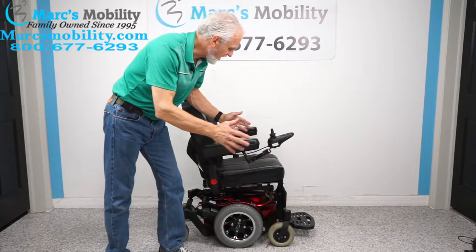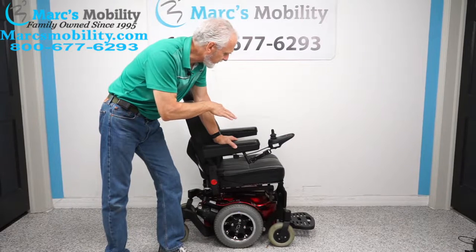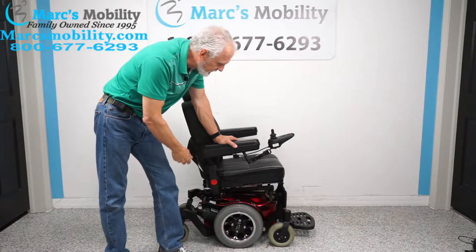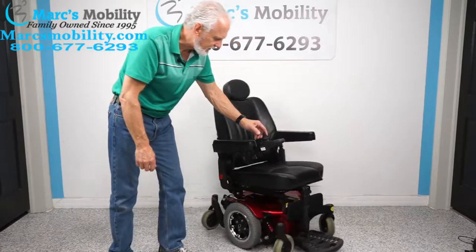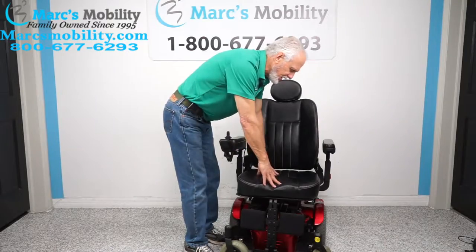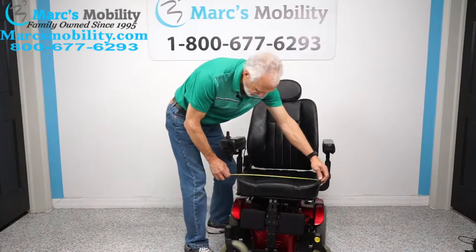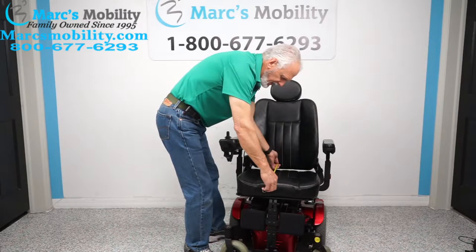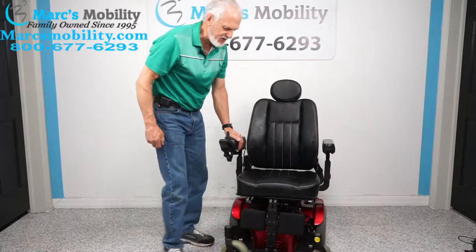It's very maneuverable and very compact. It has a captain seat. This chair is a few years old — it was sitting in someone's home for four hours, which is why everything looks new. The seat on this chair is roughly 18 by 18 — let's measure that. It's 19 wide and 18 deep.